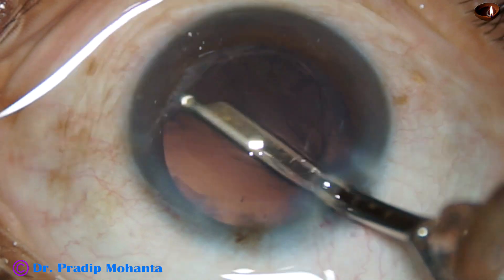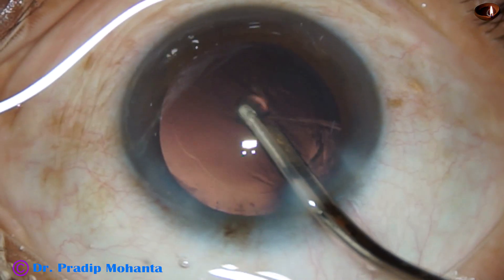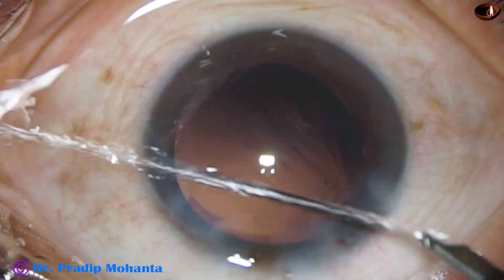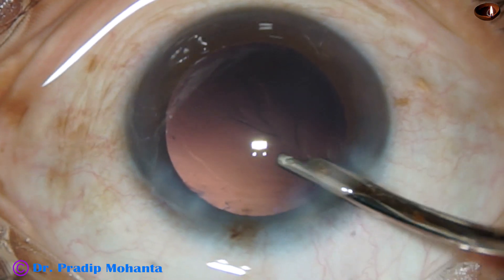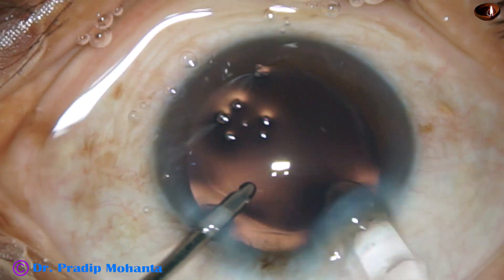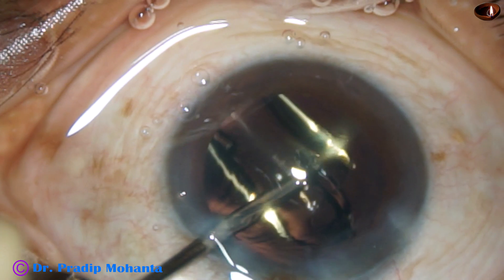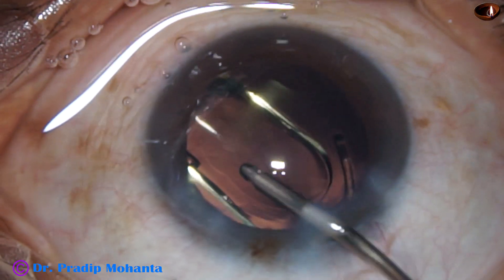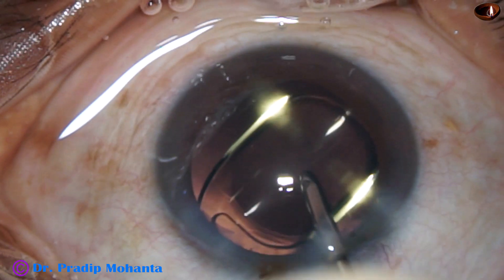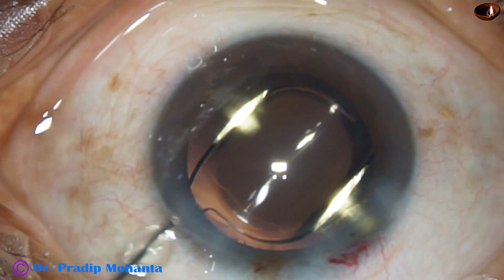Now the cortical clean-up is done with the Simcoe. The sub-incisional cortex is removed by the Simcoe going through the side port. In this case I made only one side port, so I cannot use bimanual irrigation-aspiration. This is hydro-implantation of a hydrophobic single-piece monofocal intraocular lens. The lens is dialed in, and goes nicely into the capsular bag and is settled.